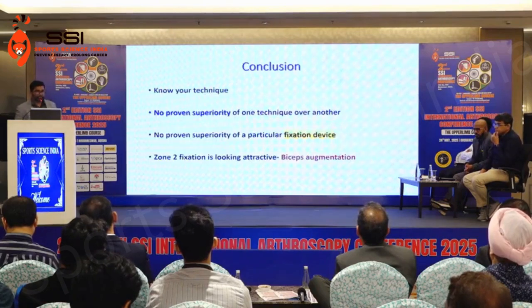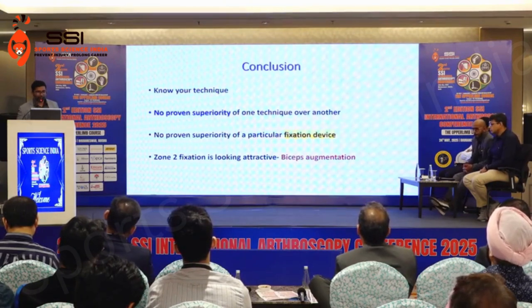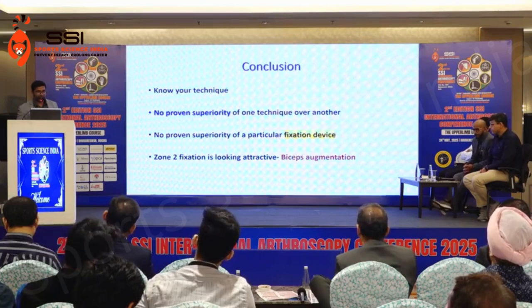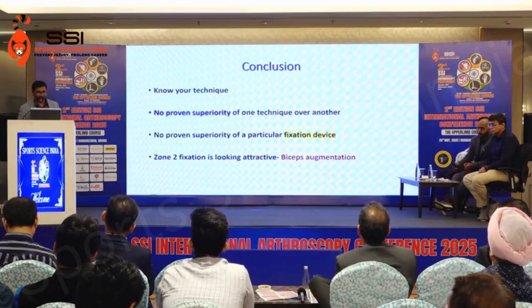So in conclusion, you should know your technique. All the techniques are okay. There is no superiority of one technique over the other, and no superiority of one particular fixation device. Of course, when you do zone 2 fixation, you can use the remaining biceps for augmentation.